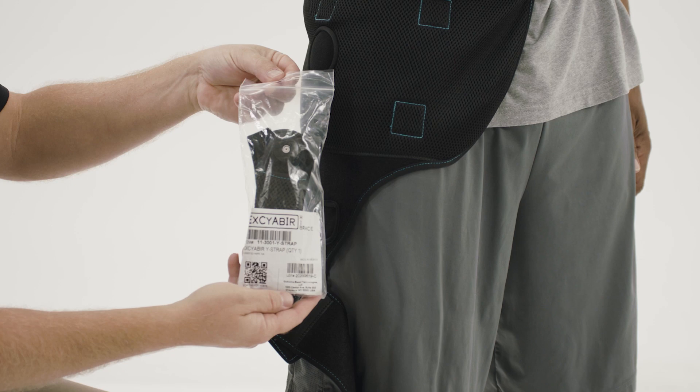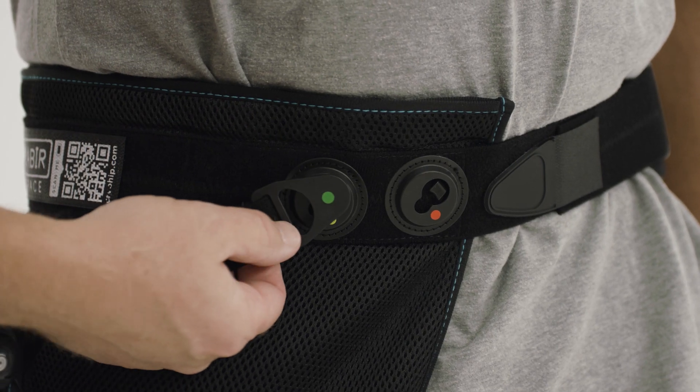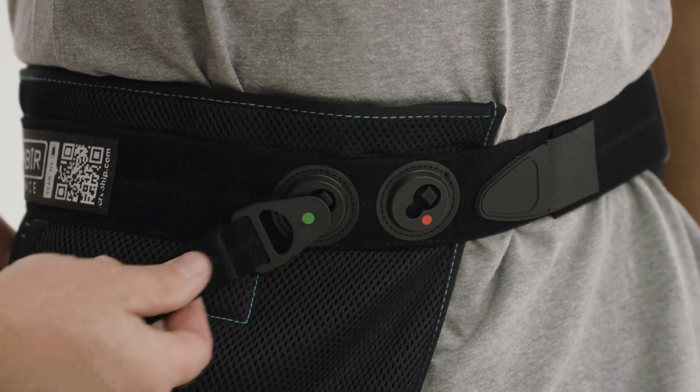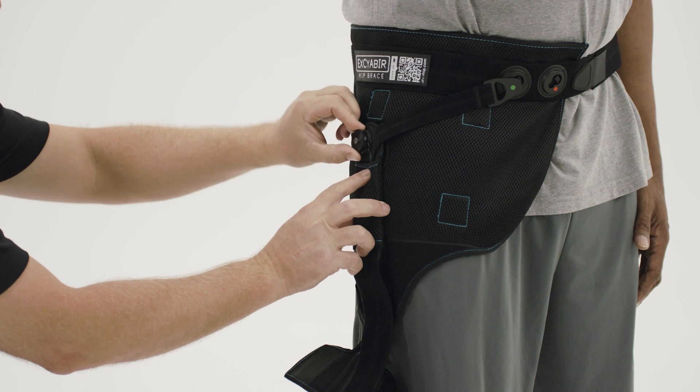Remove the hinge system from the brace. Clip in the abduction Y-strap in the green keyholes located on the front and back of the waist belt. Ensure the dial on the Y-strap is popped out and the strap end is extended.